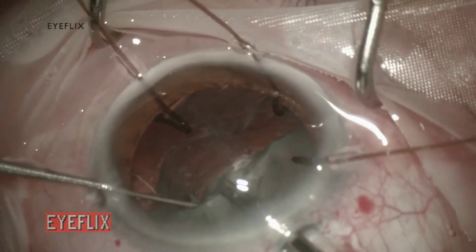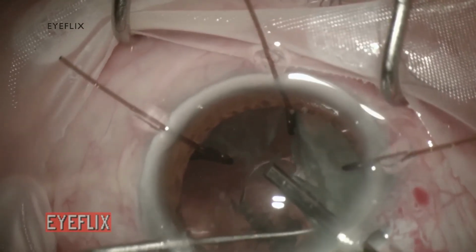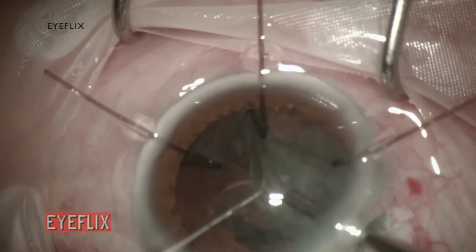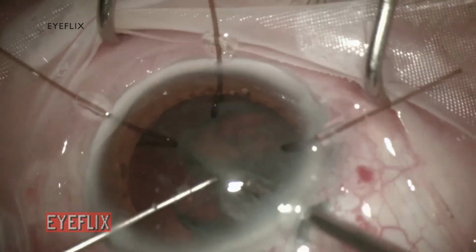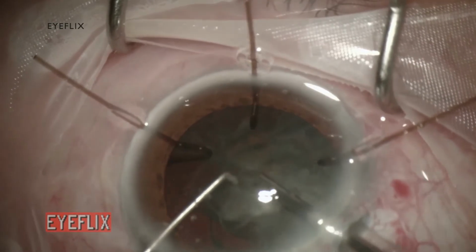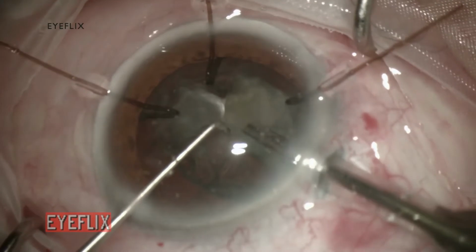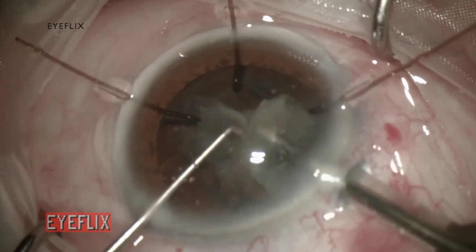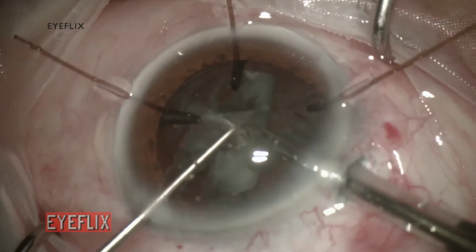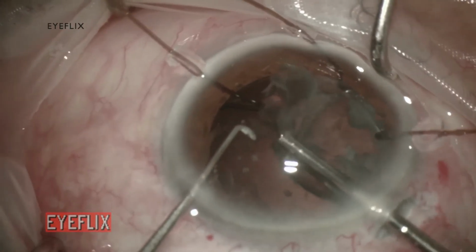Once I have aspirated the first heminucleus, I rotate the remaining heminucleus towards the phaco tip. As you can see here, the nucleus might get stuck in one of the capsular retractors. For the final fragments, I lowered the aspiration rate.